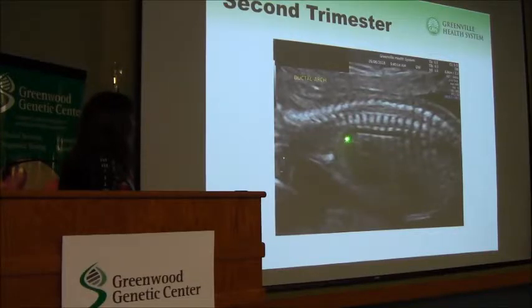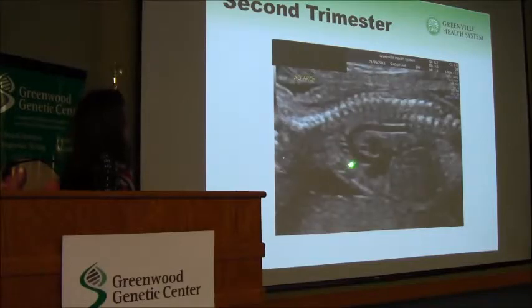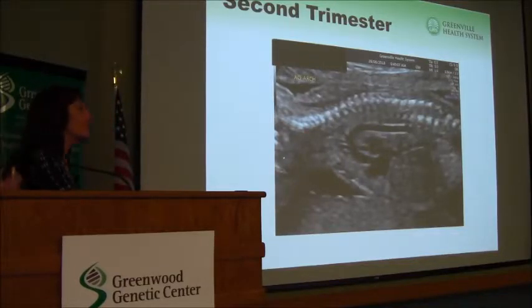This is not quite as clear in the lighting here, and it probably would light up if I had the color Doppler on, but you can see the ductal arch. It's more like a hockey stick. And then this one, I think you can see much more clearly. It's like a candy cane. This is the aortic arch with the vessels that go off to the head up here. So again, we are looking for coarctation, like you might expect with Turner syndrome.